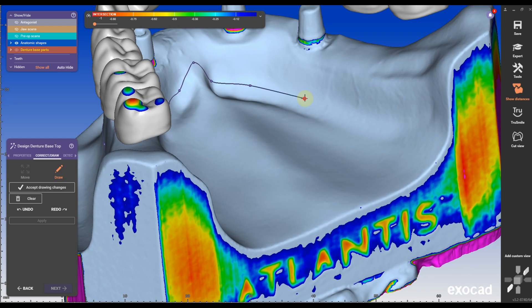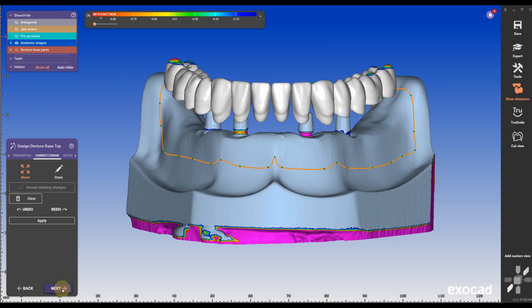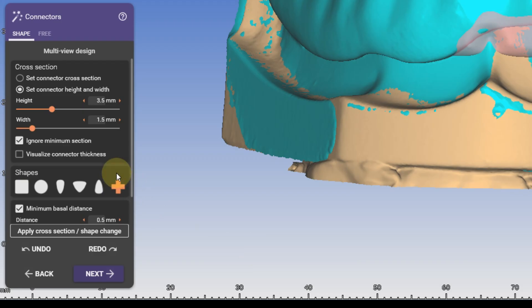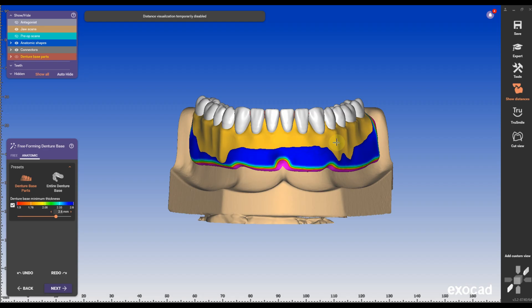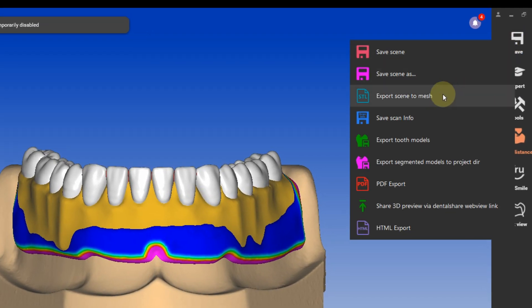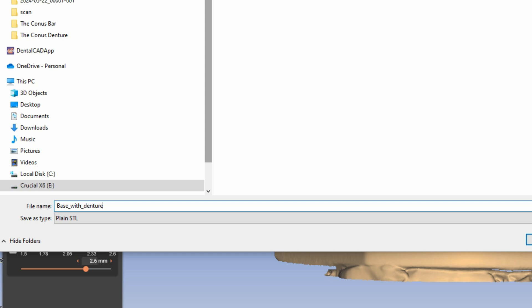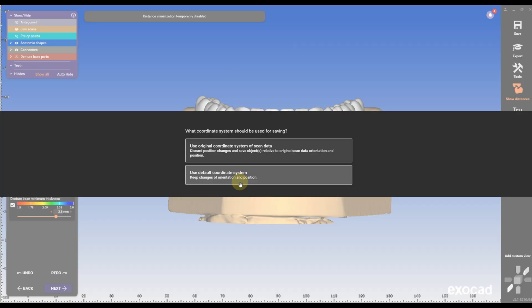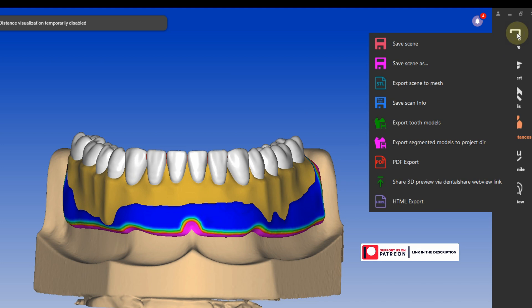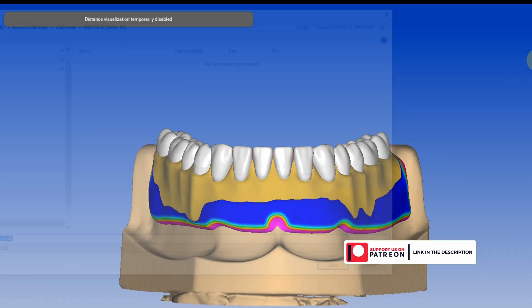The first step, the denture design, is straightforward. One of the great things about Conus is that it allows for a versatile design. You can create a full denture with a complete flange or a reduced flange for patients who need a free palate or have a gag reflex. If you don't have an antagonist, you can download the antagonist disc from my Patreon page — it's free for supporting members along with many other items.